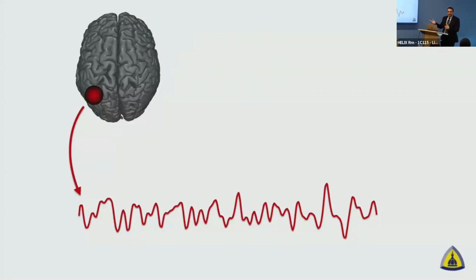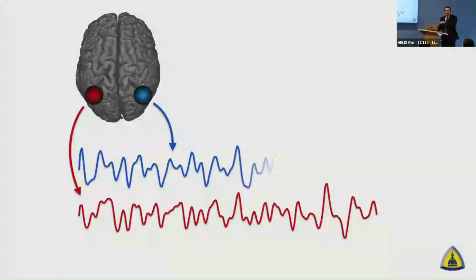Right? It just looks random. But the next part is the slightly mind-blowing part. If I put a region of interest in the opposite side of the brain, which doesn't have really direct vascular connections, but this is called the homotopic region of the brain, which is like a mirror image part of the brain, and I extract the signal, and again, I'm not making these waveforms up, this is from real data, then this is the waveform that came out from there.